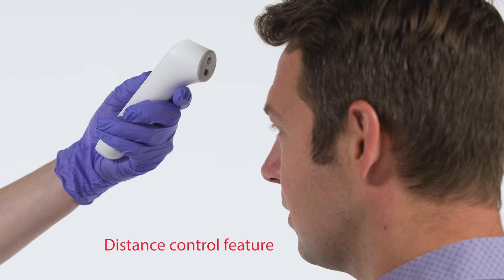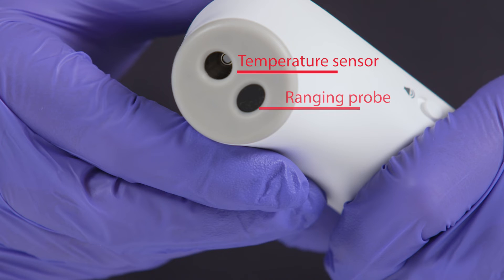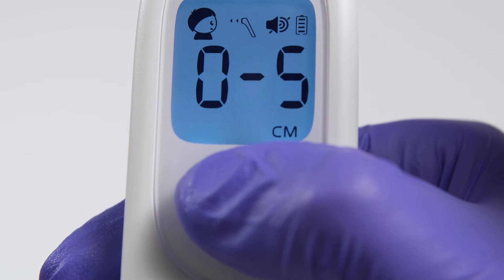First is the Distance Control feature. The Distance Sensor, also called the Ranging Probe, is below the temperature sensor and activates automatically when the Take Temperature button is pressed.